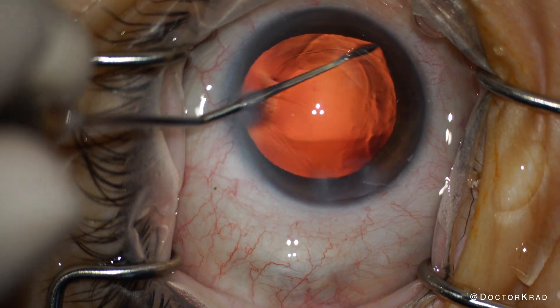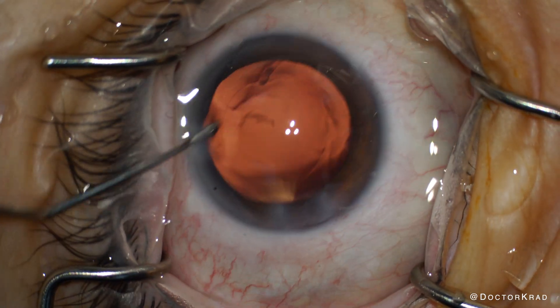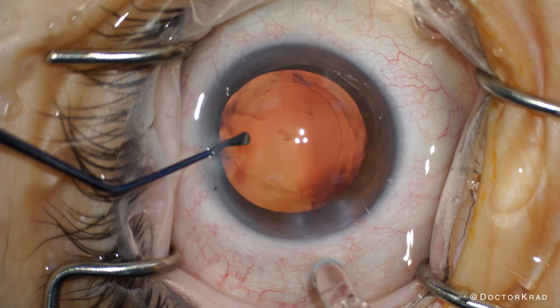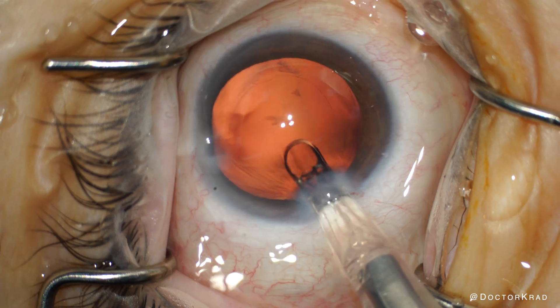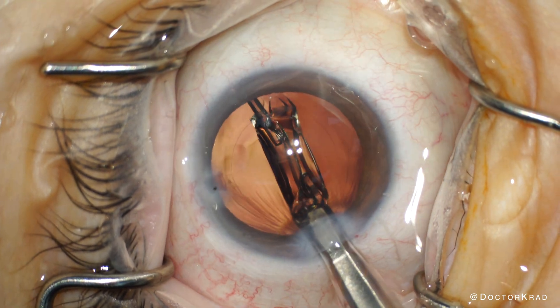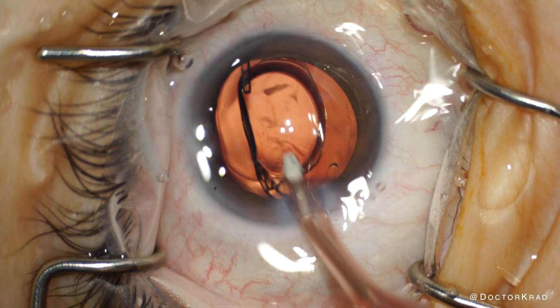Then I'm filling the capsular bag with cohesive viscoelastic and sweeping the anterior capsule with my Singer sweep polisher. I'm really hoping that this patient finds meaningful improvement of her vision. I know it's not going to be as good as the vision in her other eye, so even if there is some improvement she may not notice it, but we've got to hope for the best. Now I'm going to implant the lens — this is a monofocal lens on the NVista platform from BNL. It is hydrophobic, and I do like how it unfolds predictably without the haptics getting stuck. It has eyelets and is glistening free.